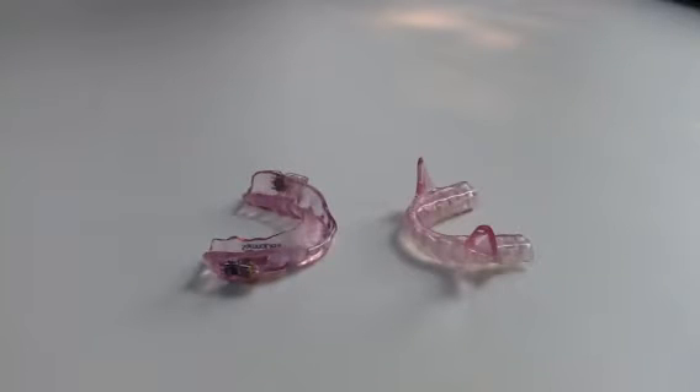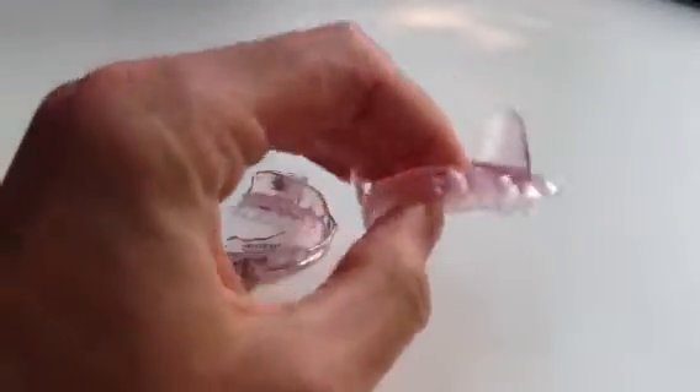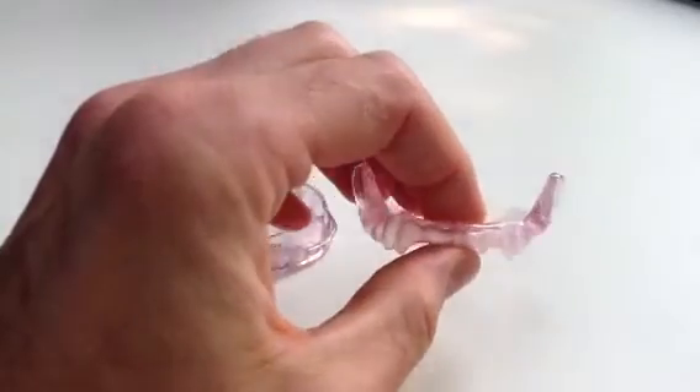This is Dr. Dan Bruce and this is a brief tutorial on how to adjust a Somnomed dental appliance. There are two pieces to the appliance. This is the lower appliance with the lower part with the fins. The adjustment is done on the upper member of the appliance.